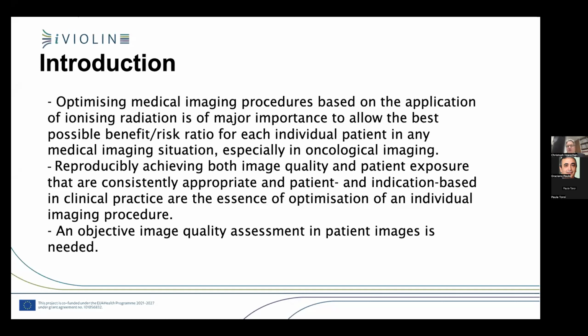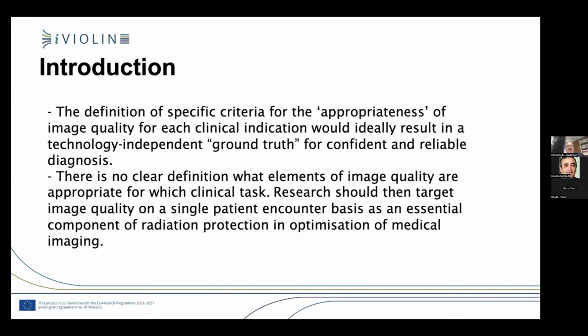At least we need to describe our systems first, and then the best possible way would be to have an image quality assessment for the images that we are using for diagnosis. For that, we need to define specific criteria for which image quality is appropriate for each clinical indication, and that would ideally result in a technologically independent ground truth for confident and reliable diagnosis.